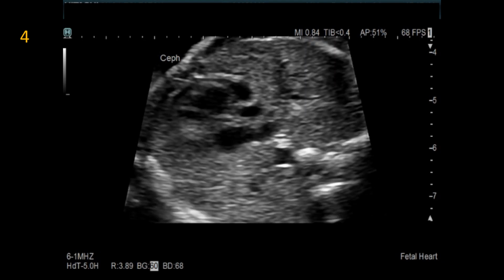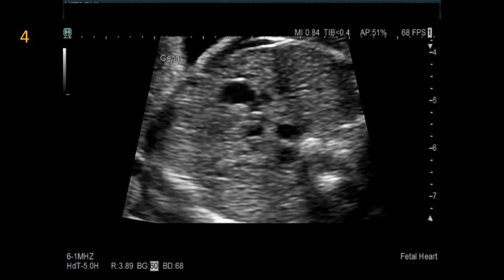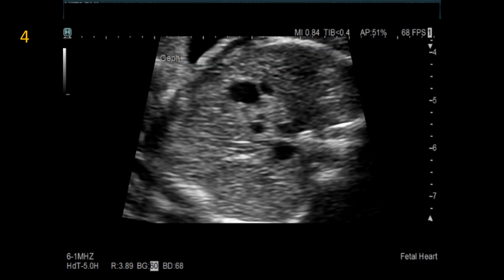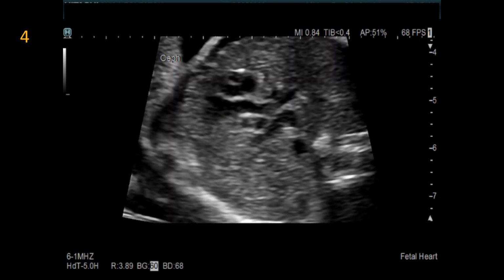At the end of this sweep, you can see bilateral superior vena cava there. Here is the ascending aorta. Here are the cavae, right-sided cava and left-sided cava. Here's the descending aorta there, and a little further we can see the pulmonary artery bifurcation here. And so these arteries are both arising from that morphologic right ventricle, smaller pulmonary artery than the aorta, but you can see that there are bilateral superior vena cava here.